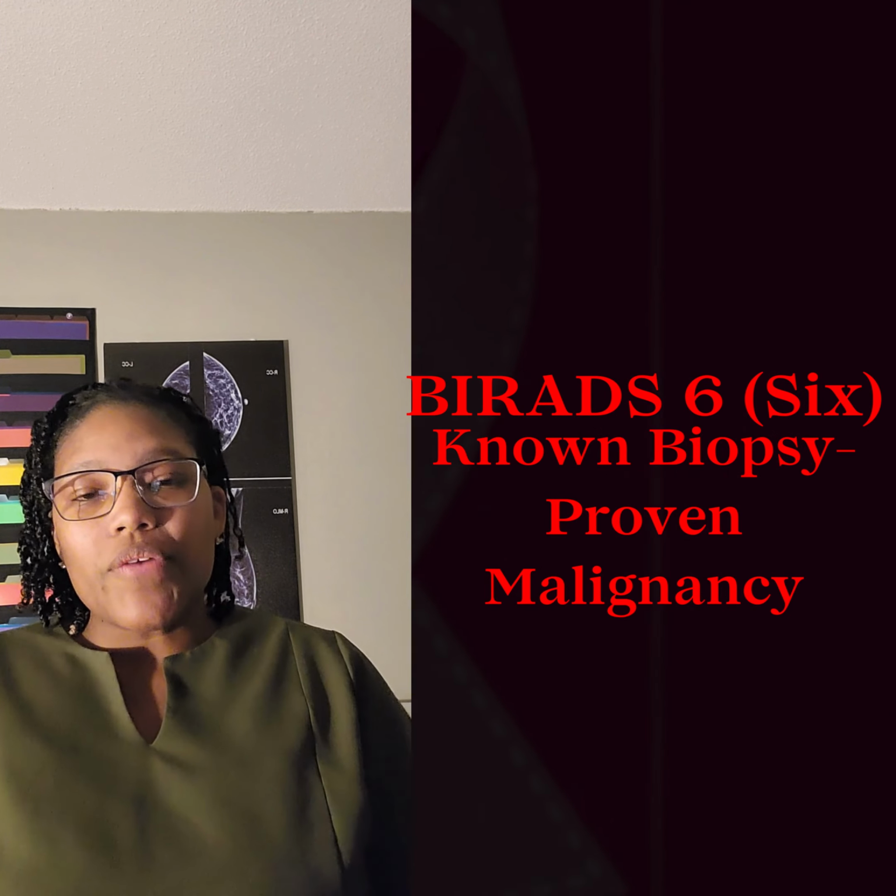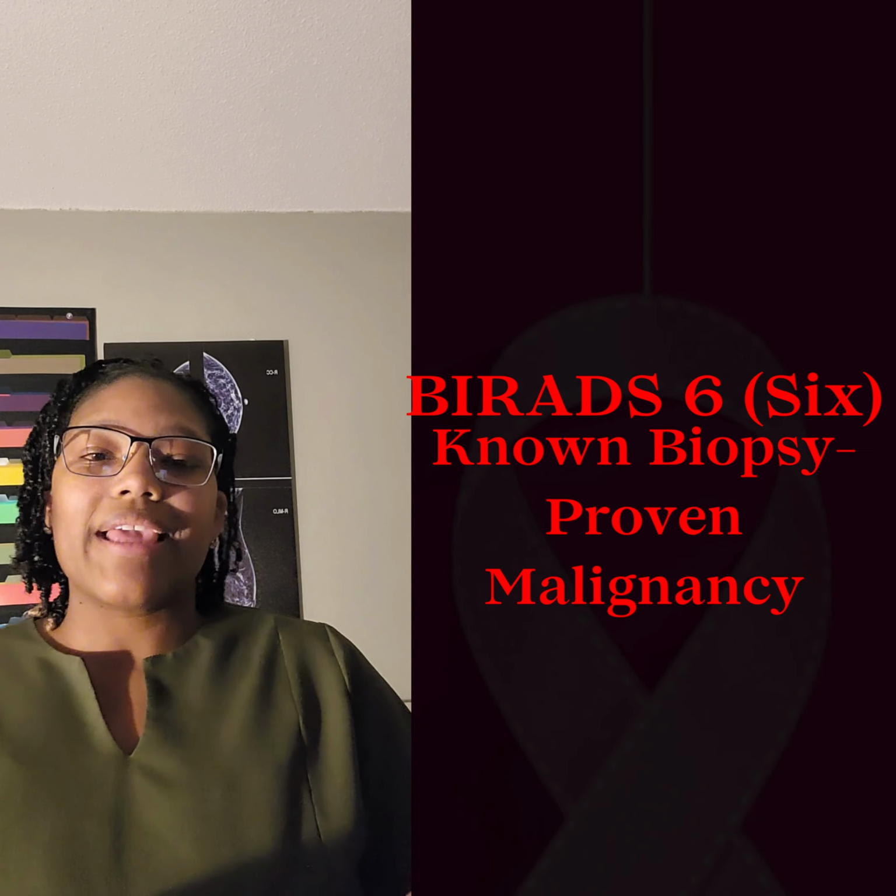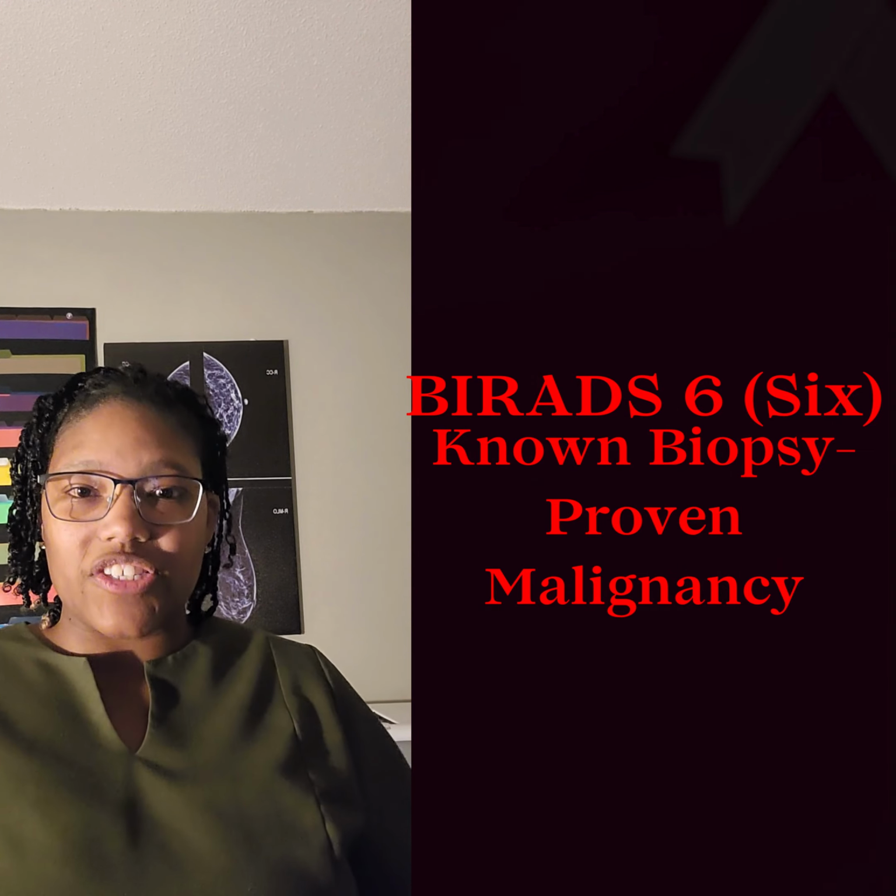The reason it would be a 5 and not a 4 is because of the characteristics of that area. That's the only way it would skip over a 4 and go straight to a 5, if the characteristics of that area of concern are like, yeah, this is cancer. And then a BI-RADS 6 is proven to be cancer, meaning the biopsy came back positive.